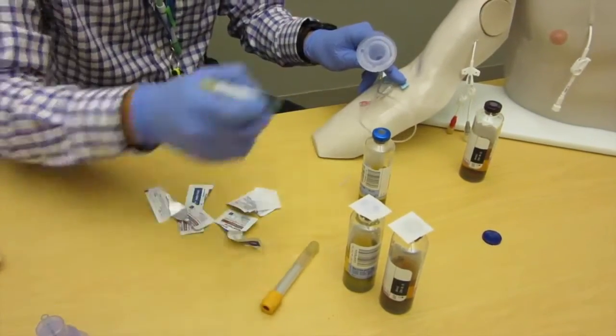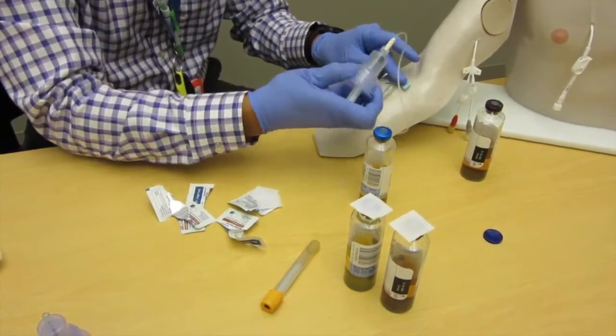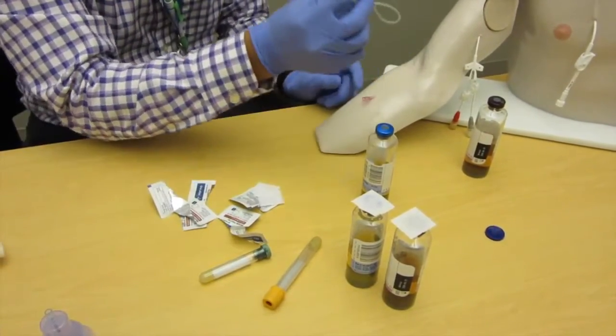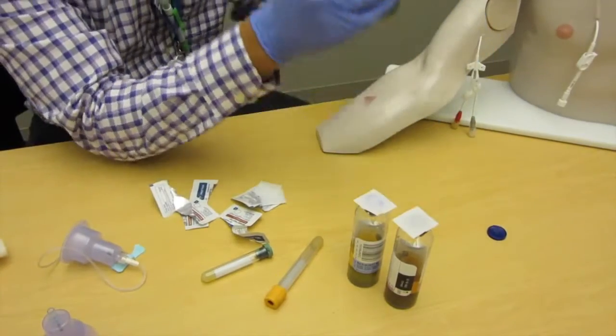Here's that piece I was telling you about earlier—plug it right back in. If you need to get troponin, CBC, Chem 7, you can do that as well using the same transfer device. Once this is done, retract it. One set of cultures done.